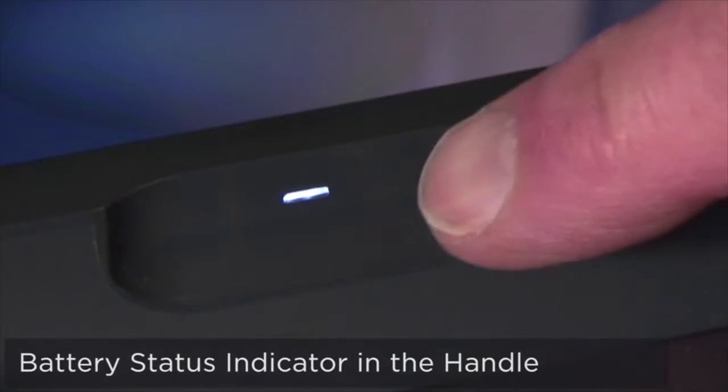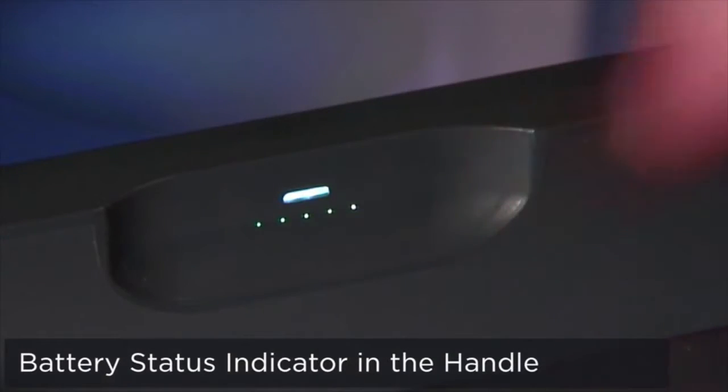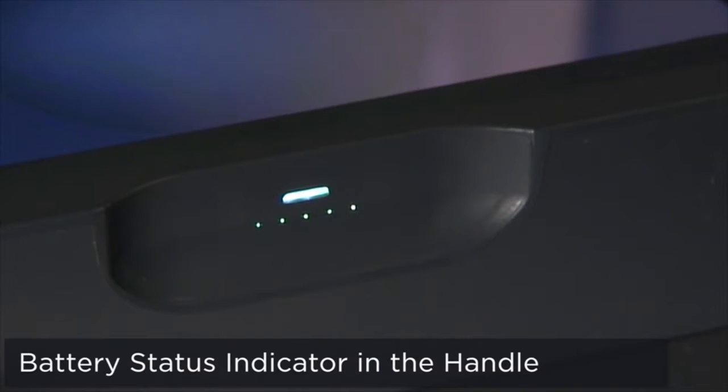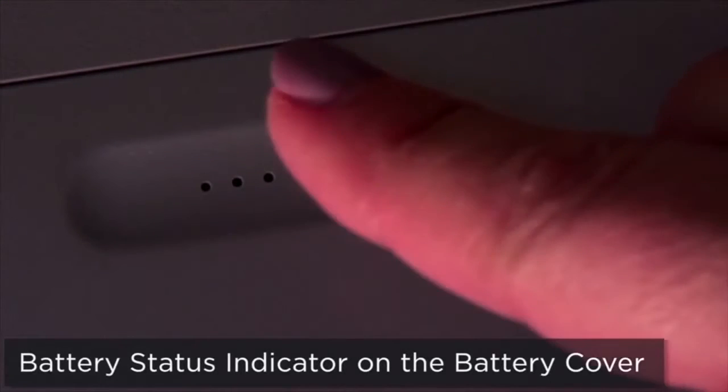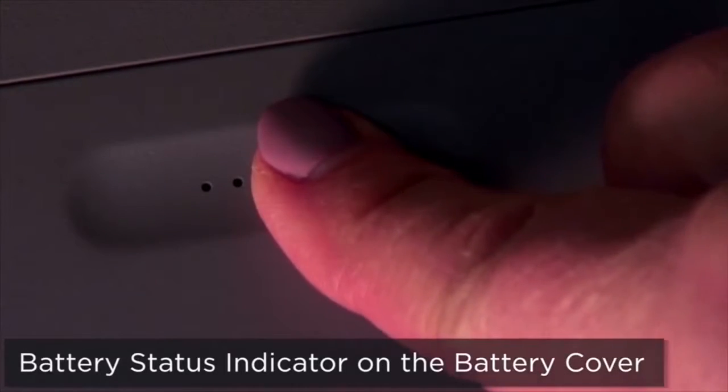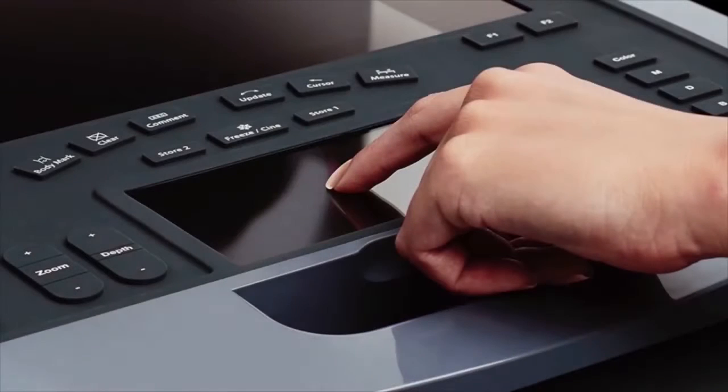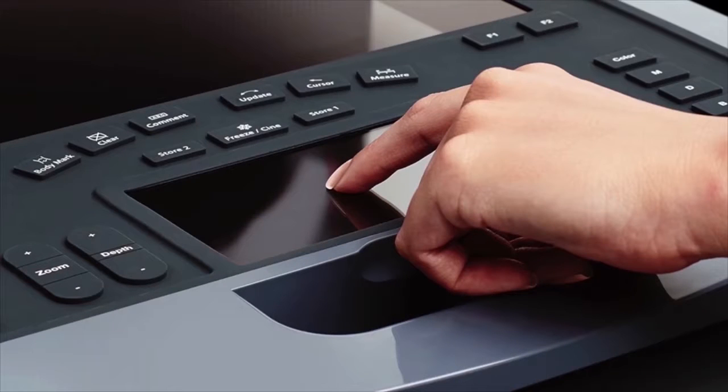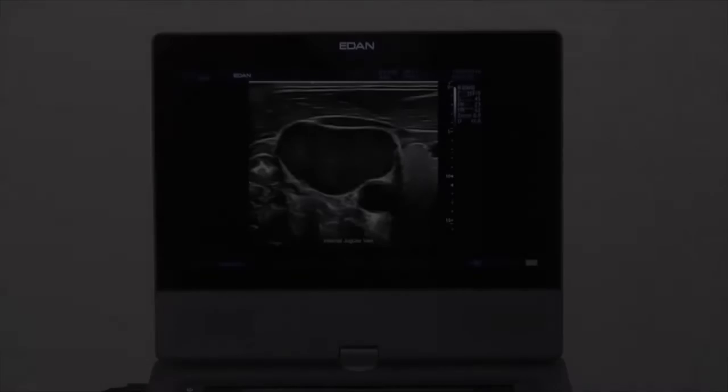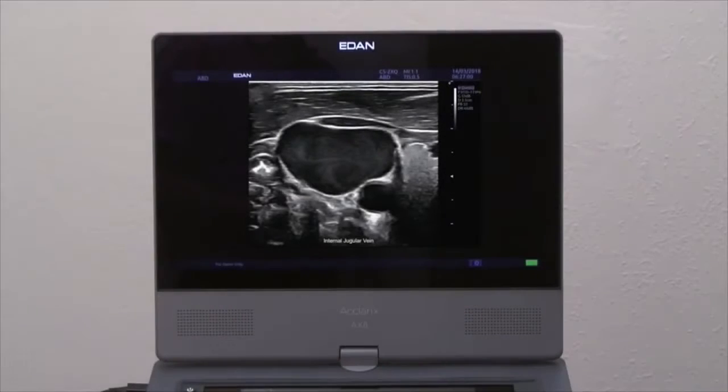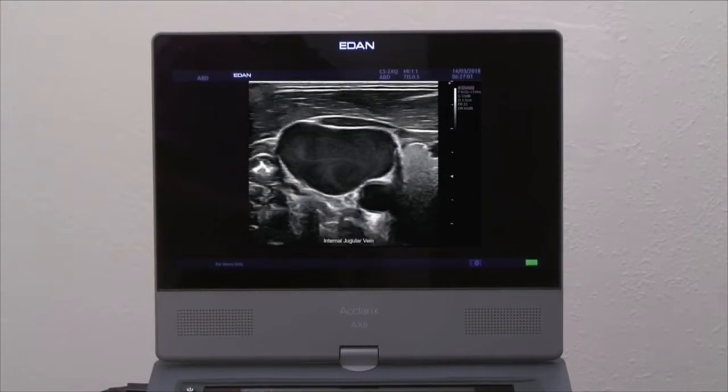There are two touchscreen sensor battery level indicators, one conveniently located in the handle and the other on the battery cover. Using the highest quality materials provides not only the exceptional fit and finish you see, but adds functionality and durability to the system.